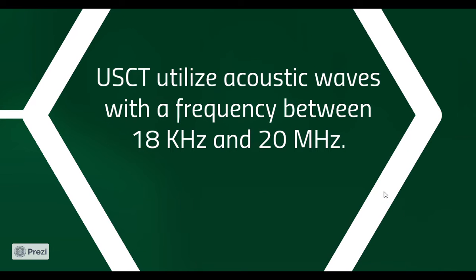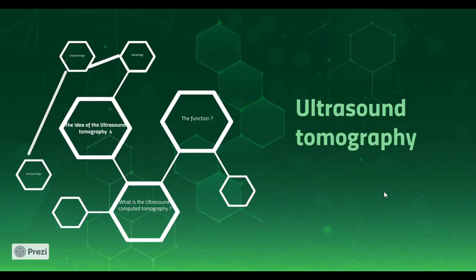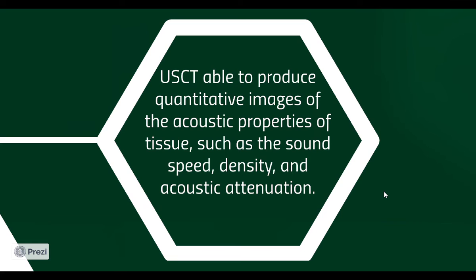And now I'm going to talk about the advantages of ultrasound tomography. Ultrasound computed tomography is able to produce quantitative images of the acoustic properties of the tissue, such as sound speed, density, and acoustic attenuation.